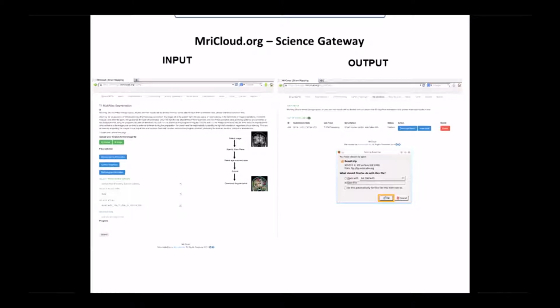We wanted to have a couple of snapshots of MRI Cloud, and so, Anthony, I think I'll just stay on this and present this. Is that okay? Anthony put this together to give you a sense of what users get to see. They log in. We currently have it so that you can be an MRI Studio enrolled person, or you can come in through other kinds of credentials.